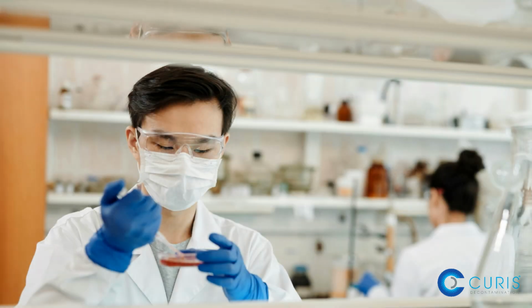Trust in sterility testing starts with the tools themselves. Whether using swabs, contact plates, or biological indicators, every validation tool must be proven, not assumed, to be effective. For biological indicators, this means a known consistent spore population, highly resistant organisms such as Geobacillus stearothermophilus or Bacillus atrophaeus, documented resistance values or D-values.